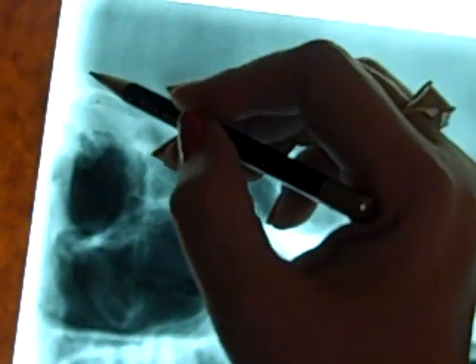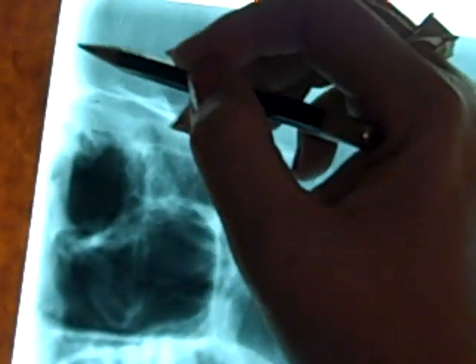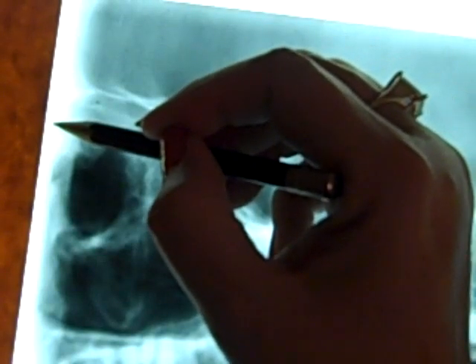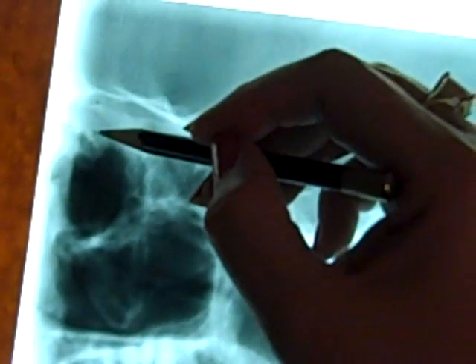A lot of films, including the one that I use in the labs, have a huge frontal sinus right here. So don't confuse the frontal sinus with the eye orbit. Eye orbit, maxillary sinus, and there will usually be a frontal sinus up in this area. This person doesn't seem to have a huge frontal sinus at all, so I would line up level with the top of the eye orbit. In fact, I tell my students that if you can't see the frontal nasal junction, the top of the eye orbit is a good alternative.